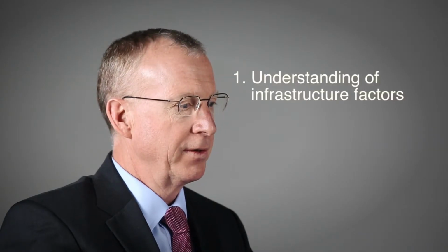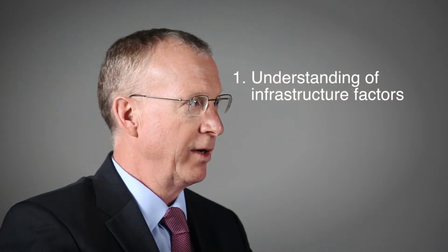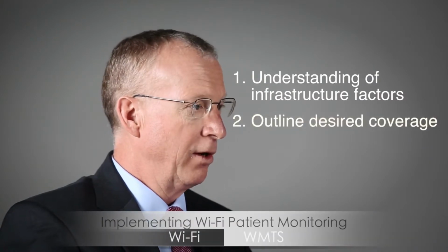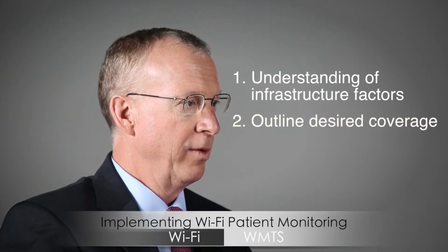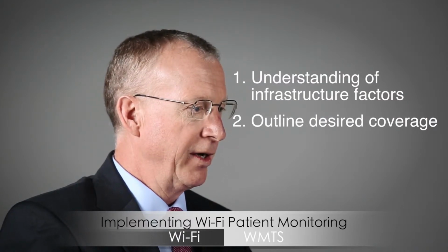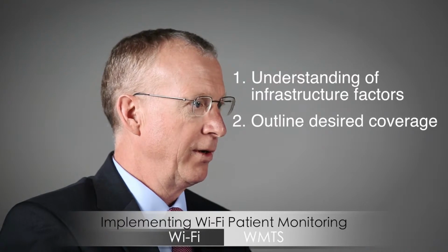So if a hospital were to implement patient monitoring on its existing Wi-Fi networks, what would be the best practices for it to follow? The first step I would ask for is the CAD drawings or the drawings of the facility. I would have the clinician or the clinical team outline where they'd want to have coverage for that patient, meaning all the rooms, all the hallways, all the elevators, where that patient would travel: the radiology, the cardiology, cath lab, cafeteria, anywhere that patient would go.